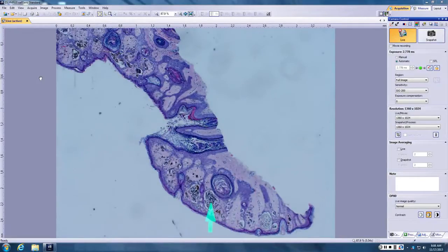They're large, and are the cells holding together, or is there white space around all the cells? So they're definitely falling apart, kind of falling apart, poorly cohesive. So what would be a small, well-circumscribed melanocytic lesion composed of big nests that are poorly cohesive? Anyone want to jump in? Special site? Yeah, those are the special site nevi.